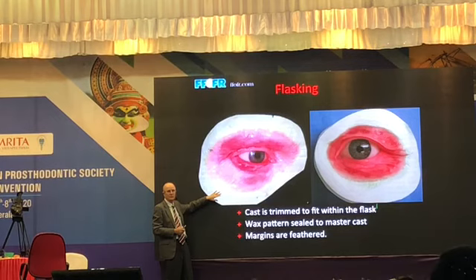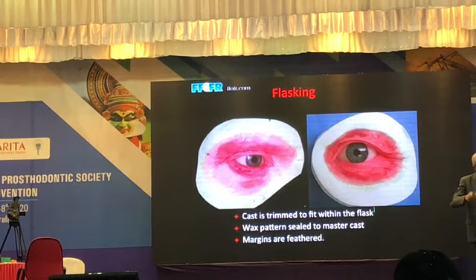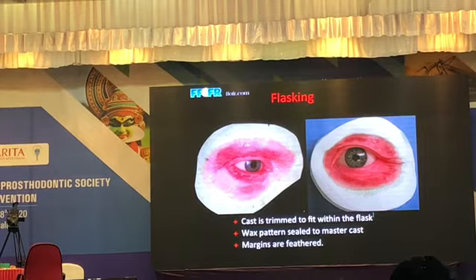You see the way this is feathered in both situations. That's real important. You want very thin margins. And that's one of the advantages of the modern silicones. The tear strength is very good, so you can make the margin very thin. You can make it so you can see right through it, which is nice.